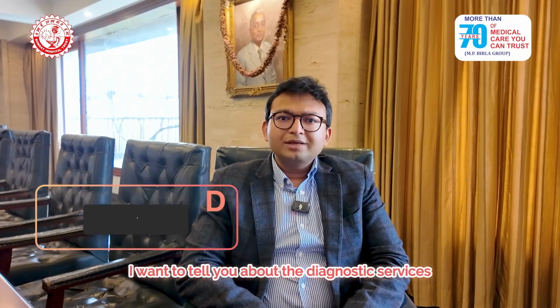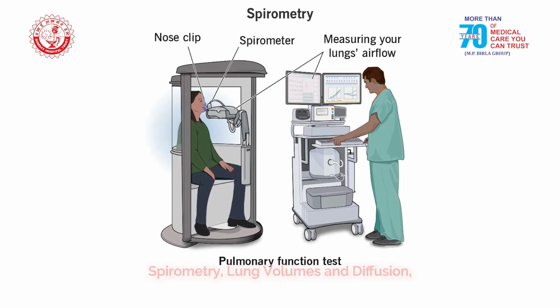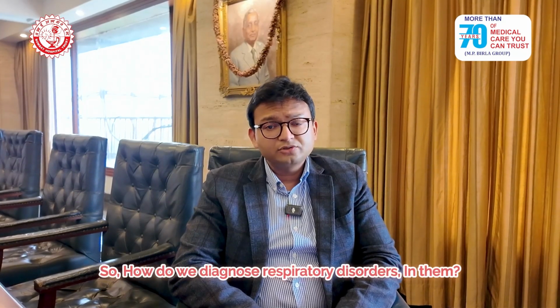I want to tell you about the diagnostic services in our lung function department. Apart from having a lung function test, spirometry, lung volumes, and diffusion, we also have a device known as an Impulse Oscillometry and FeNO. Very often we see patients who are unable to exhale and unable to perform a lung function test. So how do we diagnose respiratory disorders in them?